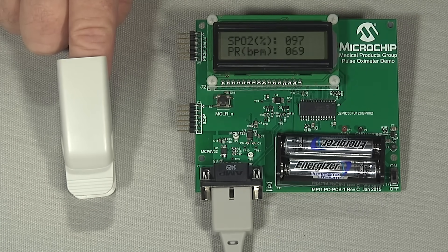There, the DSPIC33 has measured and calculated my heart rate and blood oxygen level. It reads 97% blood oxygen level and a heart rate of 70 beats per minute. That's correct — it's good to know that I'm healthy.